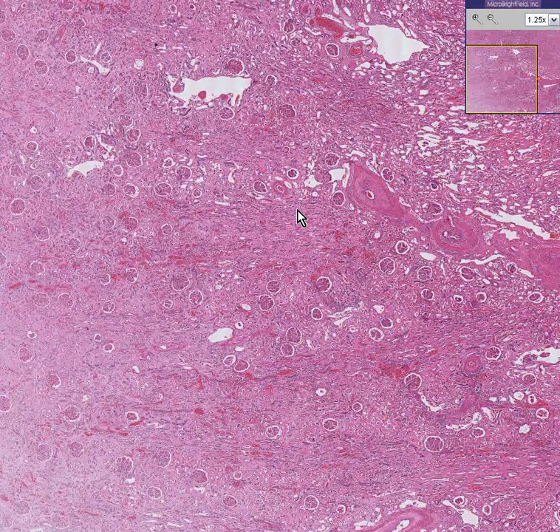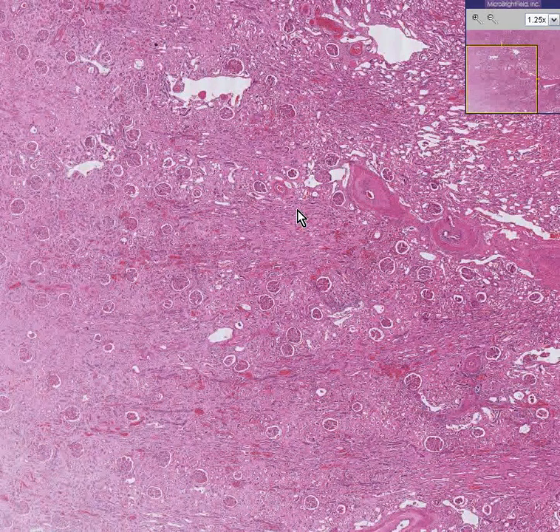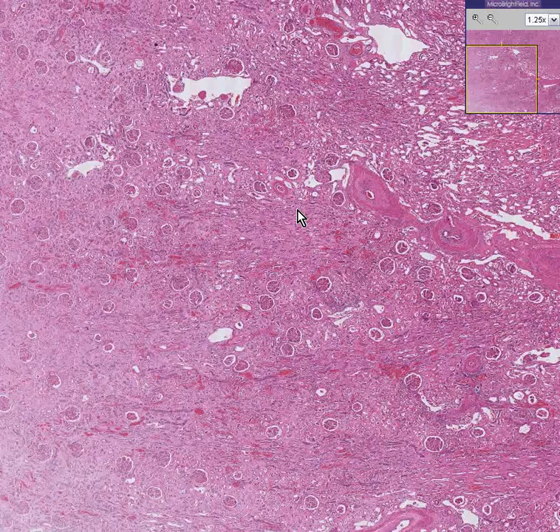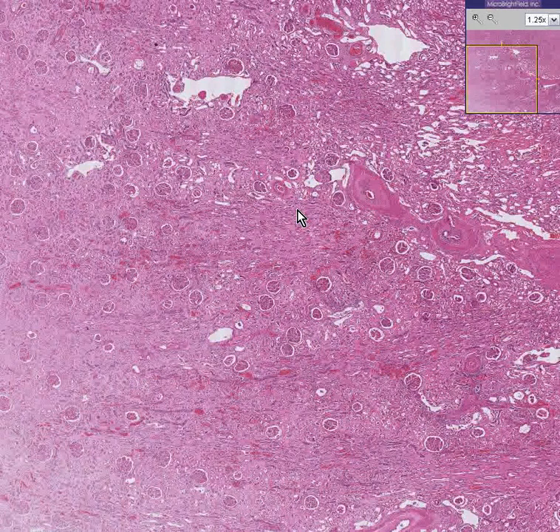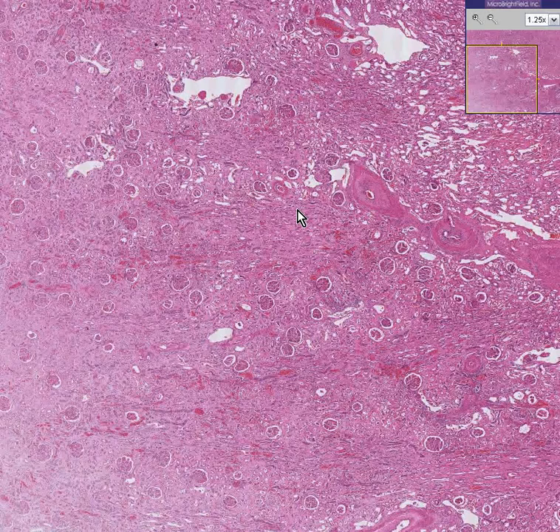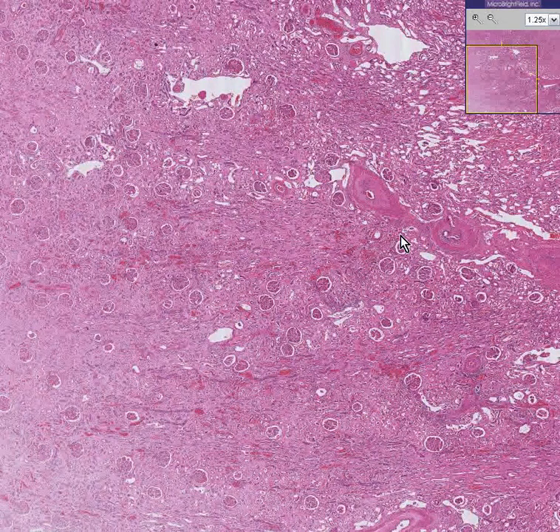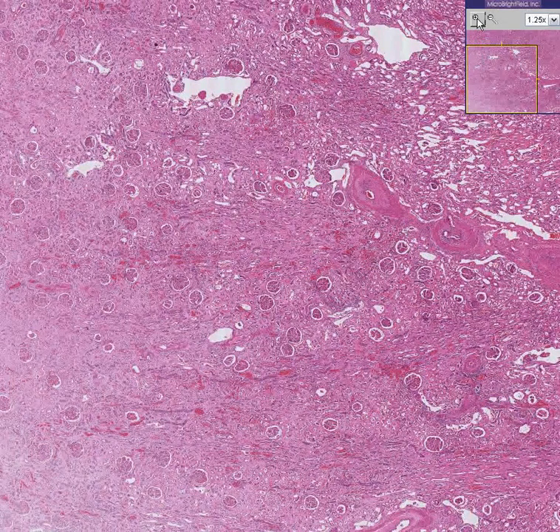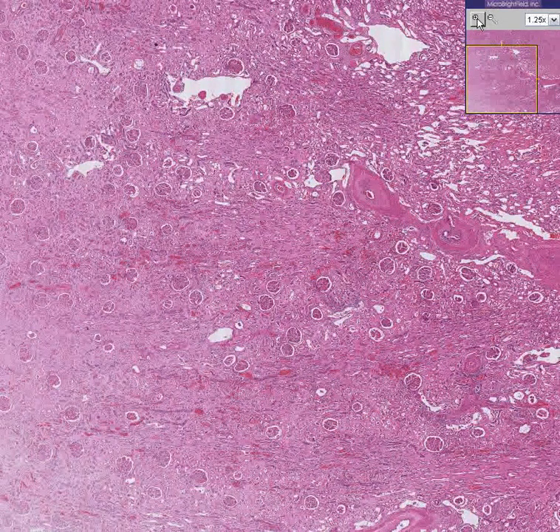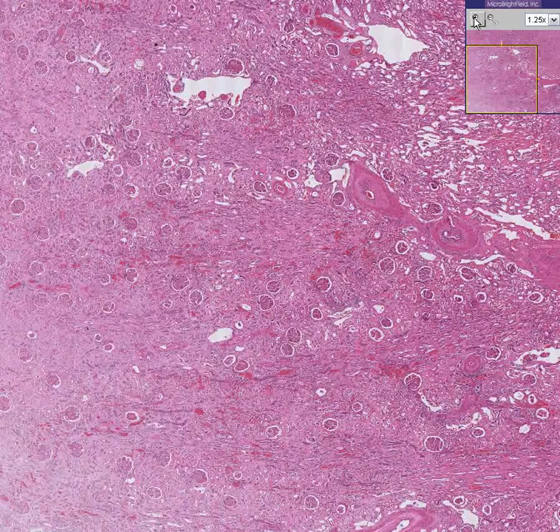And then we have the acute pattern in which we have a cellular infiltrate, chiefly lymphocytes, attacking the transplant. And in this case, we have a chronic transplant rejection. There are several things that go on with chronic renal transplant rejection.